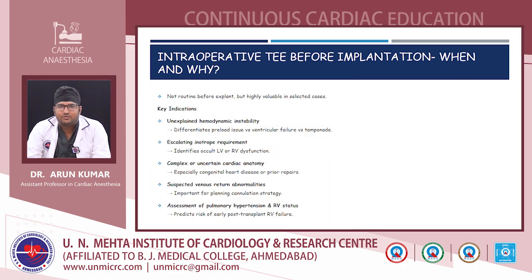Usually pre-implant TE is not mandatory in every transplant, but in the right patient it gives us a powerful hemodynamic roadmap before we go on bypass. This allows targeted correction before going on bypass.